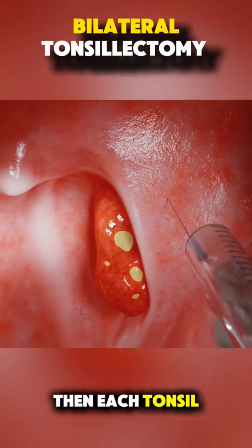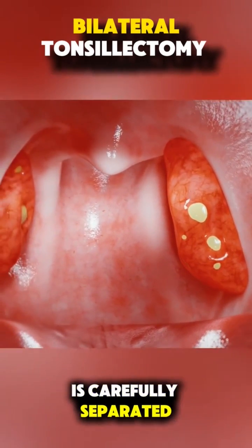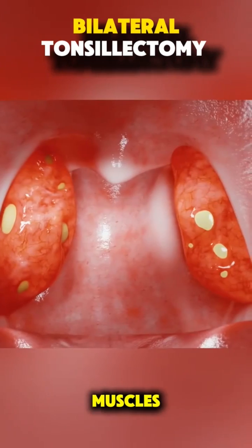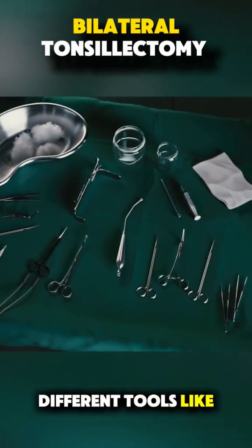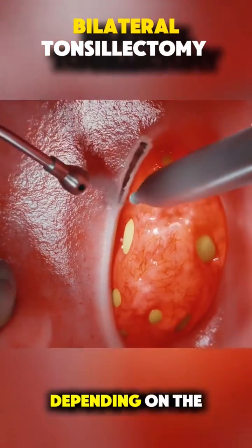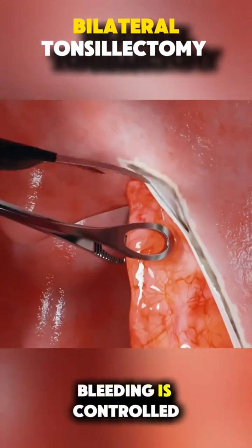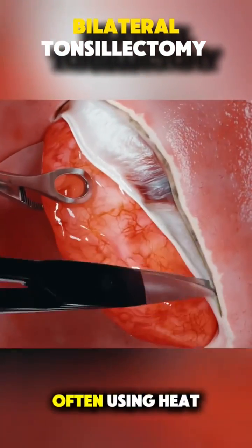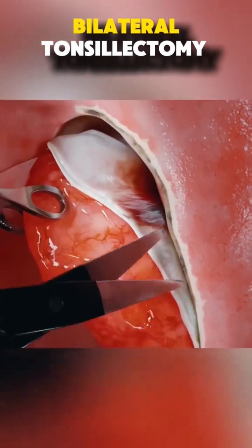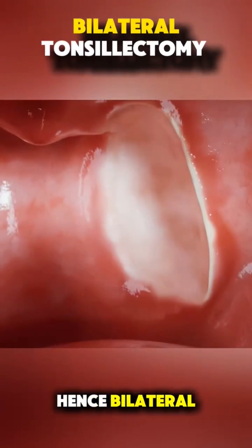Then, each tonsil — those two oval-shaped tissues at the back of your throat — is carefully separated from the surrounding muscles. Surgeons can use different tools like scalpels, electrocautery, or even lasers, depending on the technique. As the tonsils are removed, bleeding is controlled immediately, often using heat to cauterize the blood vessels. The process is then repeated on the other side — hence bilateral.